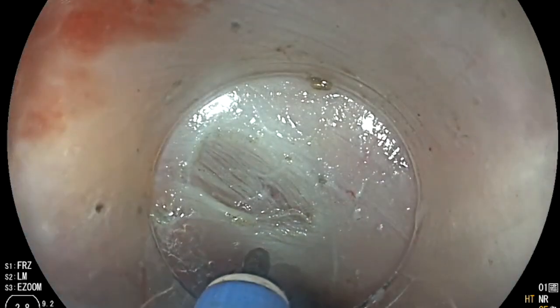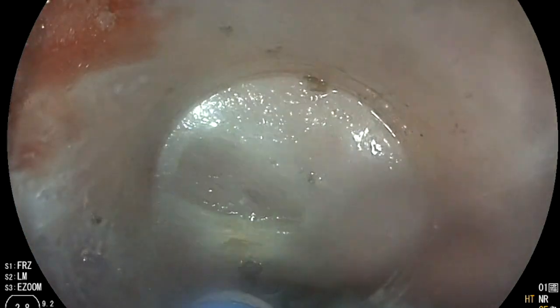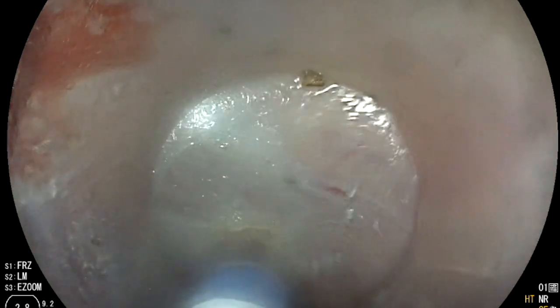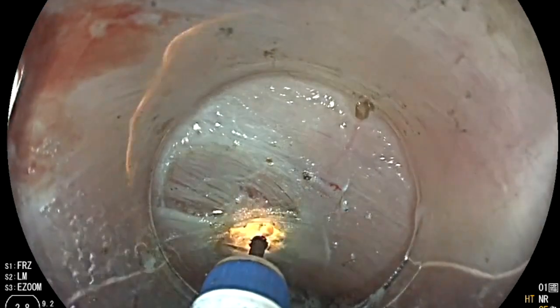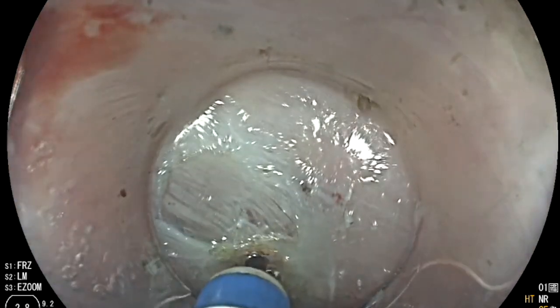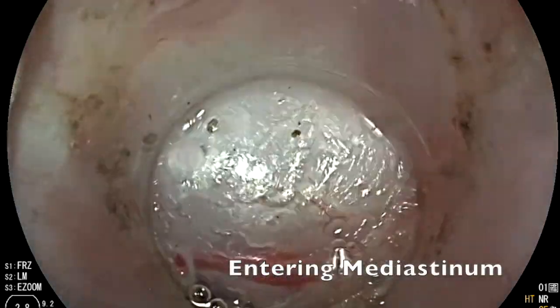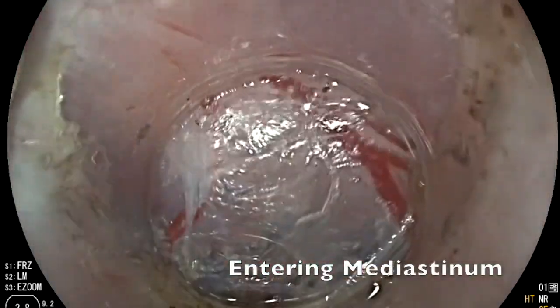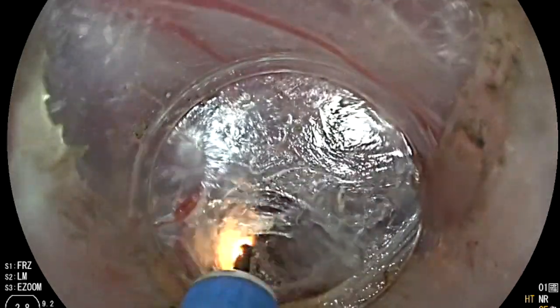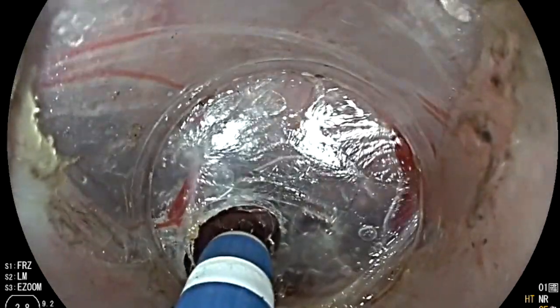However, here we completely incise the esophageal wall to allow passage of the endoscope into the mediastinum. We then dissect caudally in the mediastinum using cautery to break up the areolar tissue as we move distally along the wall of the esophagus.